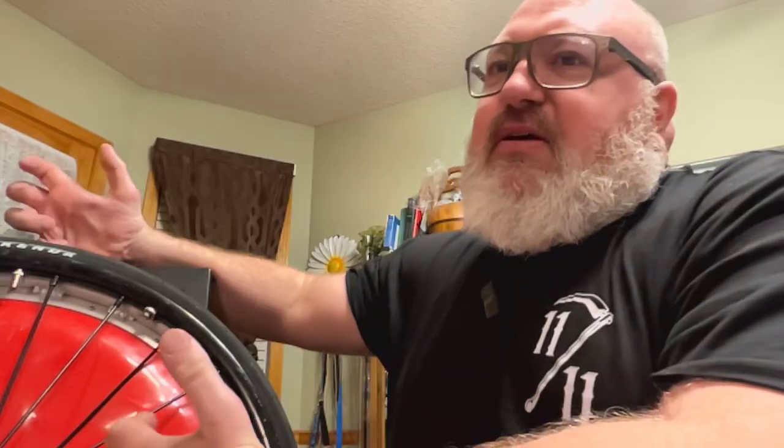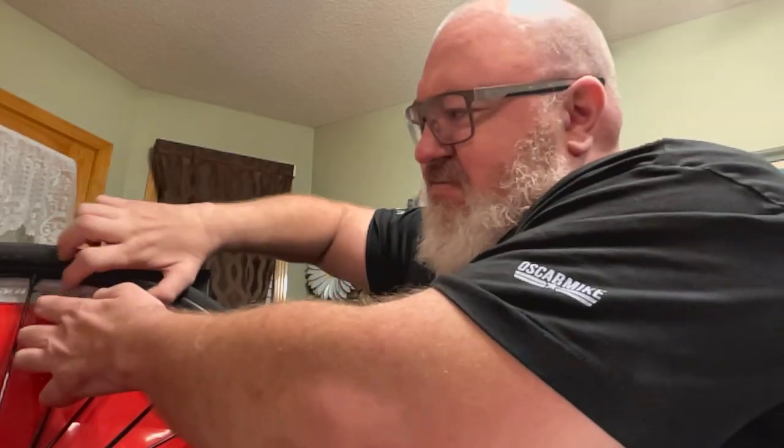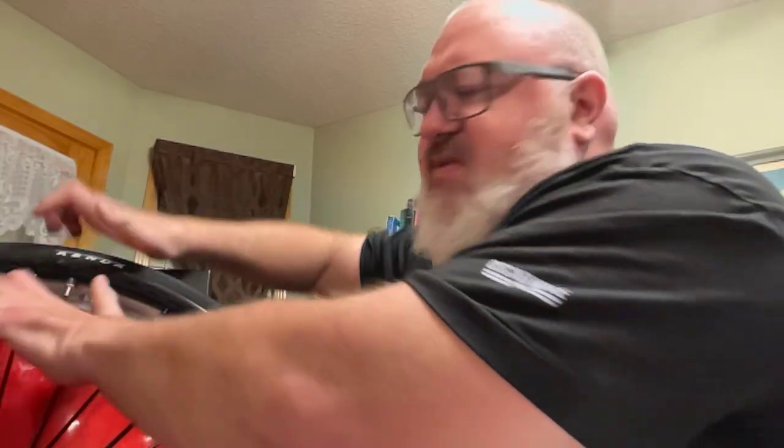So I'm going to explain how I change tires. It may or may not work. You will hear me cuss, cry, scream. If I walk away or pause it and then come back the next day, that's 100% something I'll do.